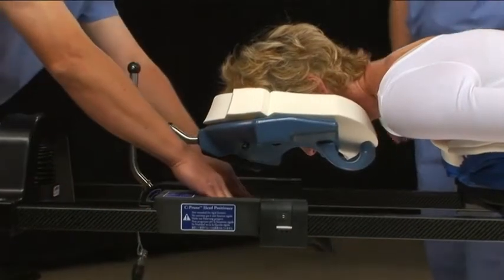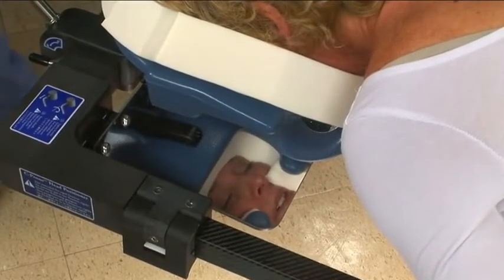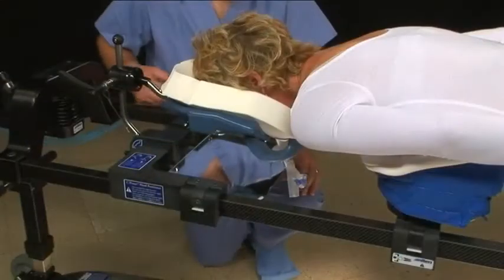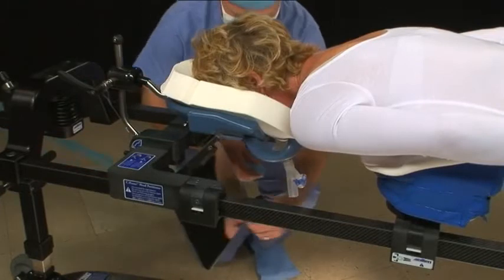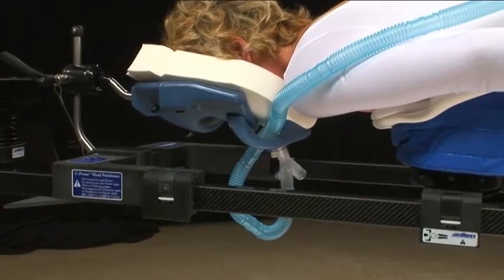Adjust the mirror so that you can see the patient's face. The patient's eyes should be visible and free from pressure. The patient's chin should be fully supported on the chin rest. The intubation tube can be attached through the center of the mask, or it can be placed in the channel near the patient's chin.